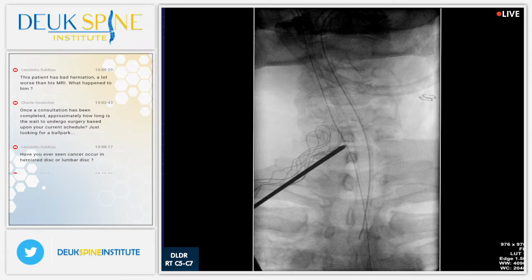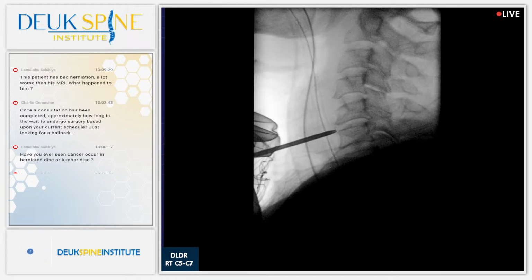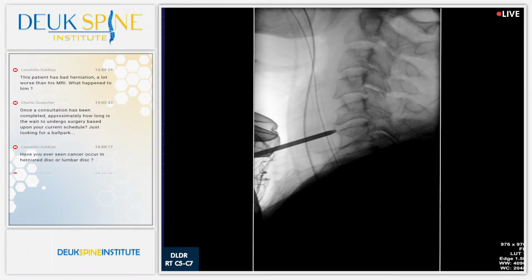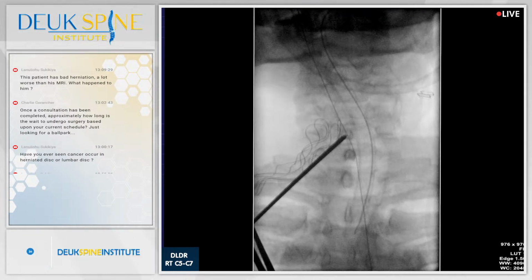Any questions? At this moment, no current questions. We're going to go up to the next disc using the dilator. Now we're there. I need to check the AP again. AP is front back view. You do not want to be off to the side. If you go off to the side, it's very bad. Shot, lateral, it's perfect in the middle. Perfect. And it's easy to slide to the side, by the way. I've done it before.